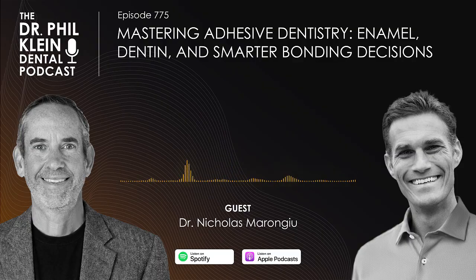And that agitation of the dentinal surface is allowing the solvent to evaporate off. If I put too much in there, not only do I draw off, but I'll have the assistant with the high volume suction right next to the tooth help to draw off that excess solvent. But really agitating that surface, air thinning just until the ripples stop, and then curing that surface before moving forward.